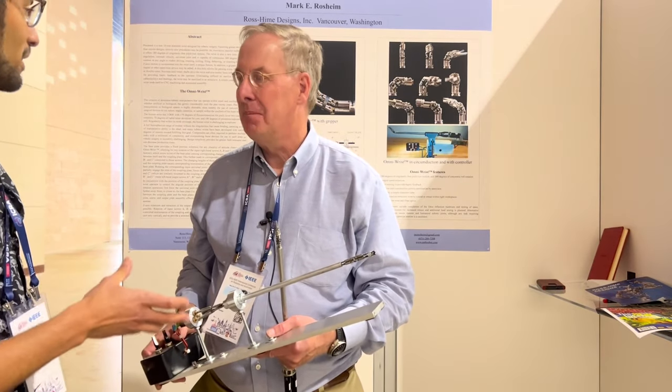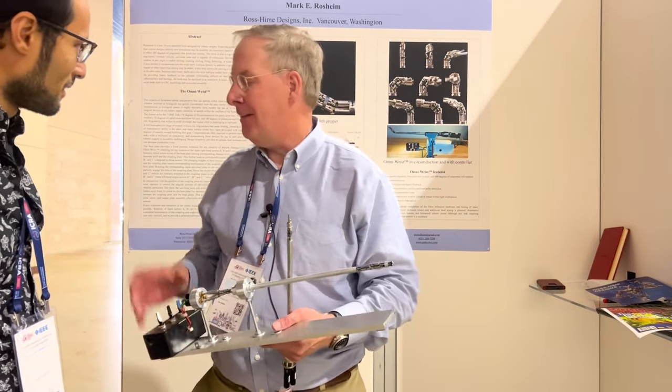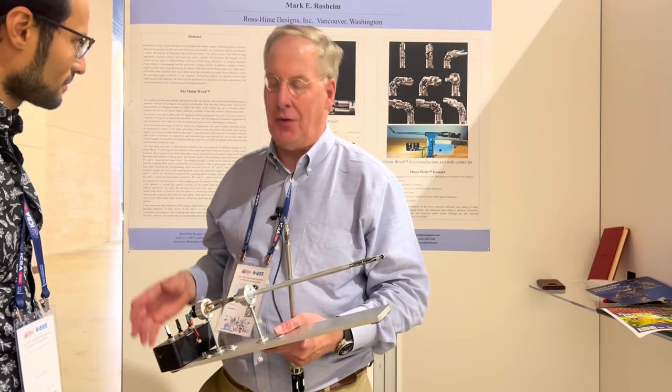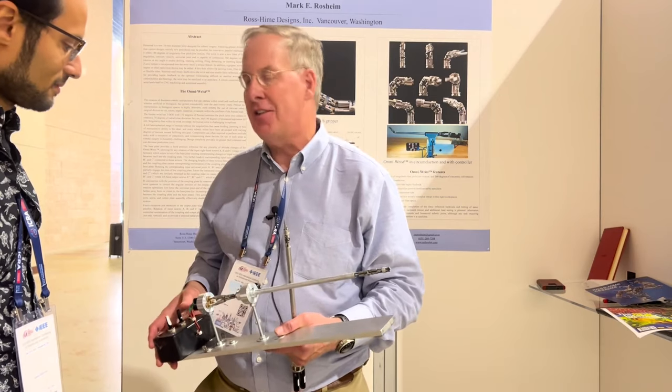And so is your background — are you with the company? Yeah, this is my company, Rossheim Designs. We've been around for a long time, but we just recently came up with this new technology and we're excited to present it here at IEEE ICRA.